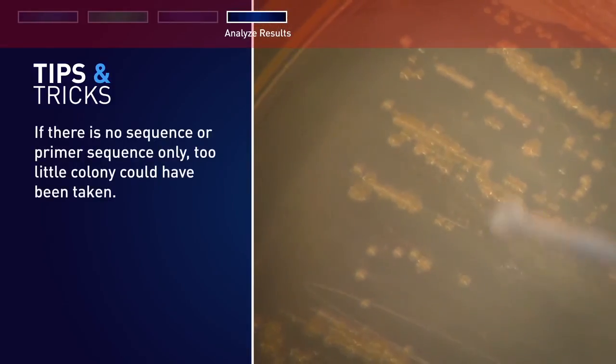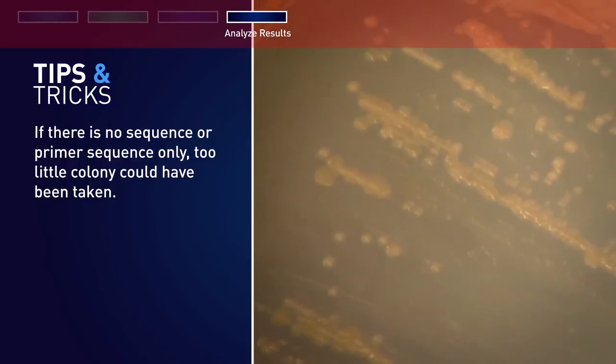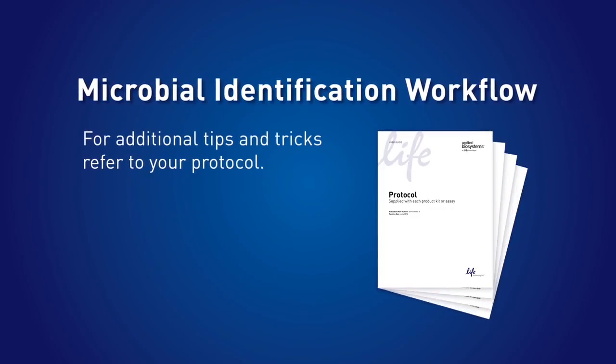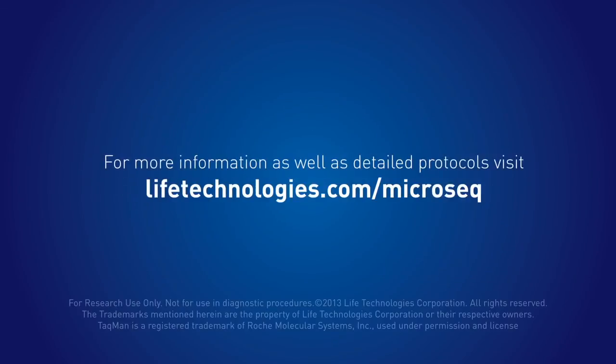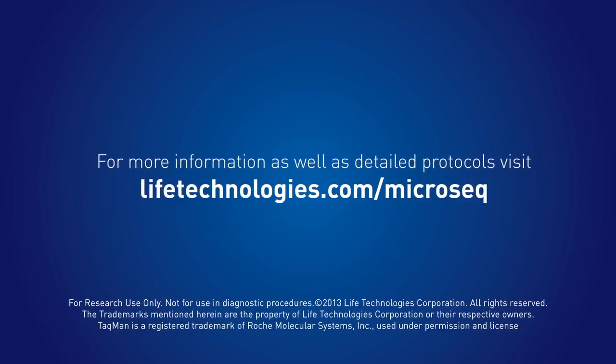If there is no sequence or primer sequence only, too little colony could have been taken. For additional tips and tricks, refer to your protocol. For more information as well as detailed protocols, visit lifetechnologies.com/MicroSeq.